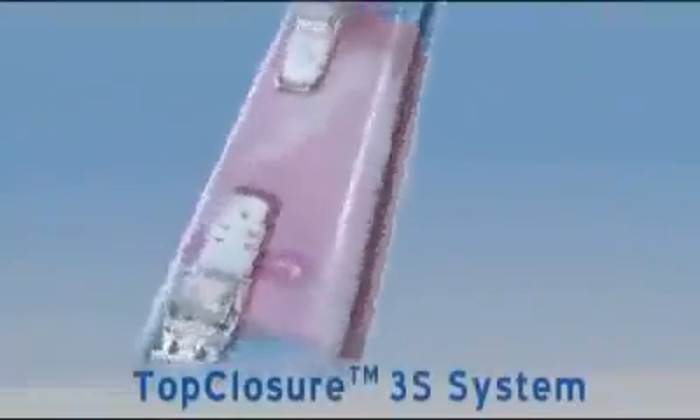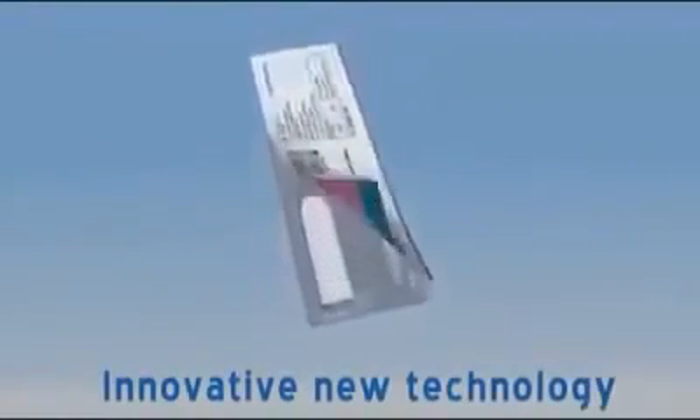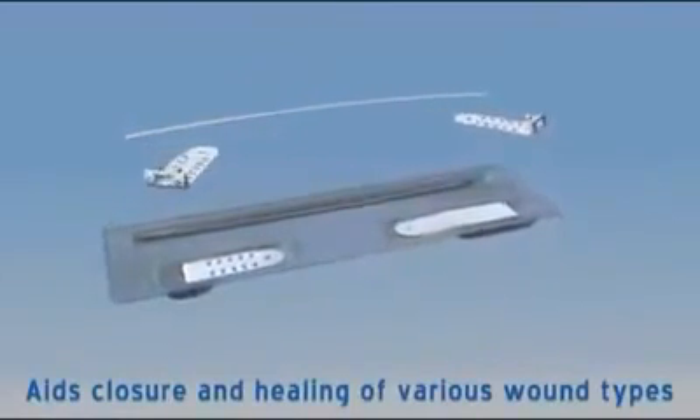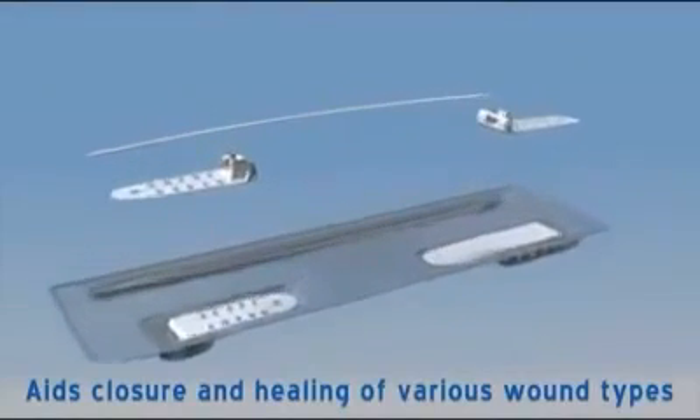The TopClosure 3S system is an innovative new technology created for skin stretching and secure wound closure. The system temporarily stretches skin tissue to aid closure and healing of post-traumatic, surgical, acute and chronic skin wounds.